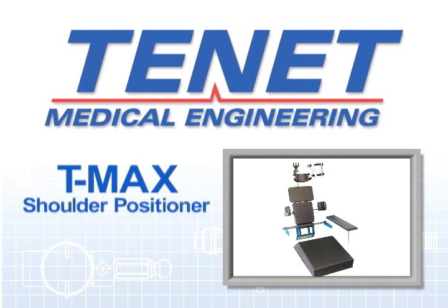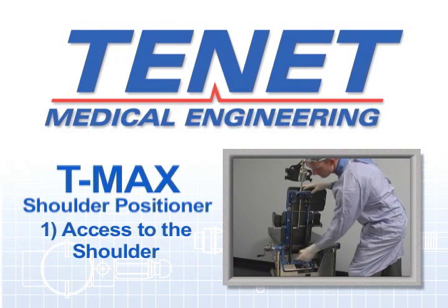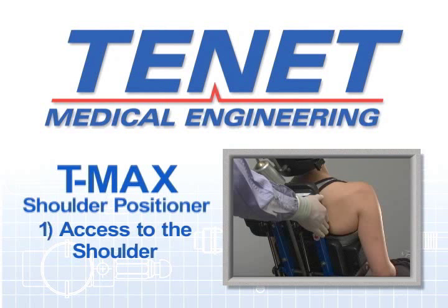The three main issues were: first, access to the shoulder. The TMAX was designed to provide better access and exposure to the shoulder joint and position it as close to the surgeon as possible. The TMAX was designed to fit on the table with the head or leg sections removed or folded down, allowing an assistant to stand directly behind the patient without having to lean over the table.